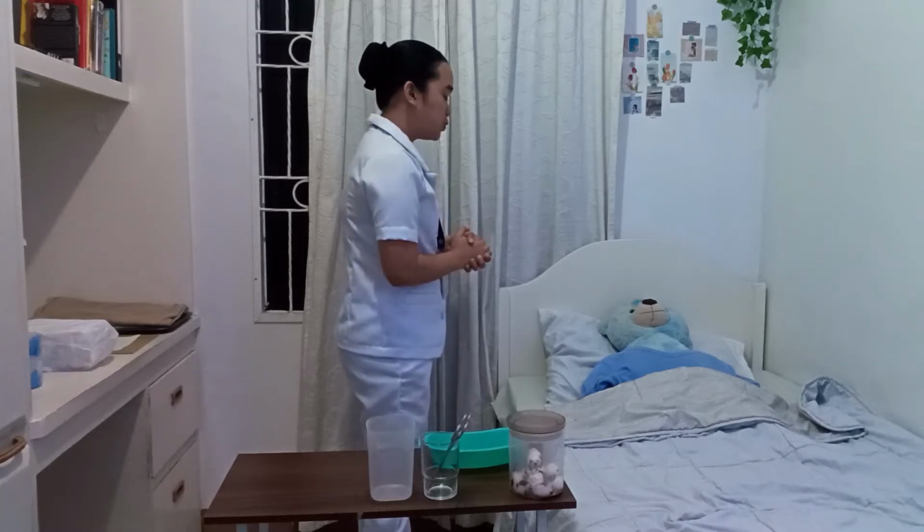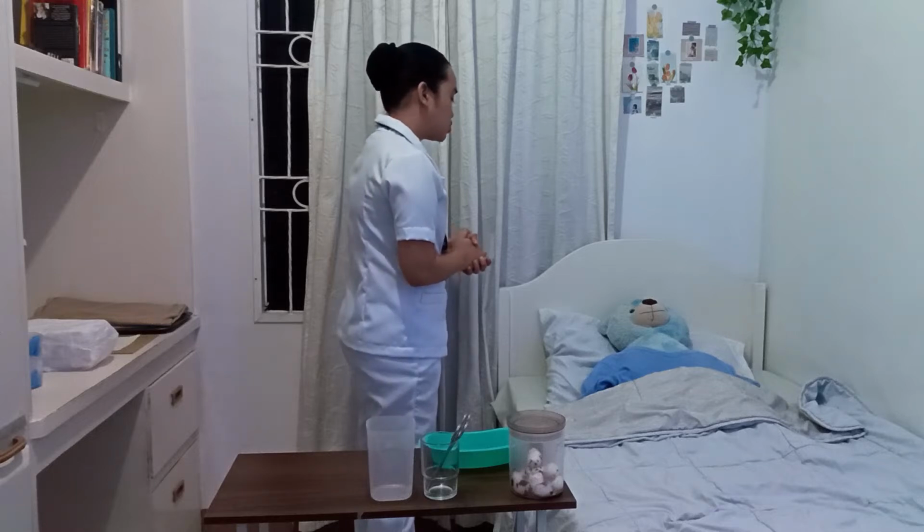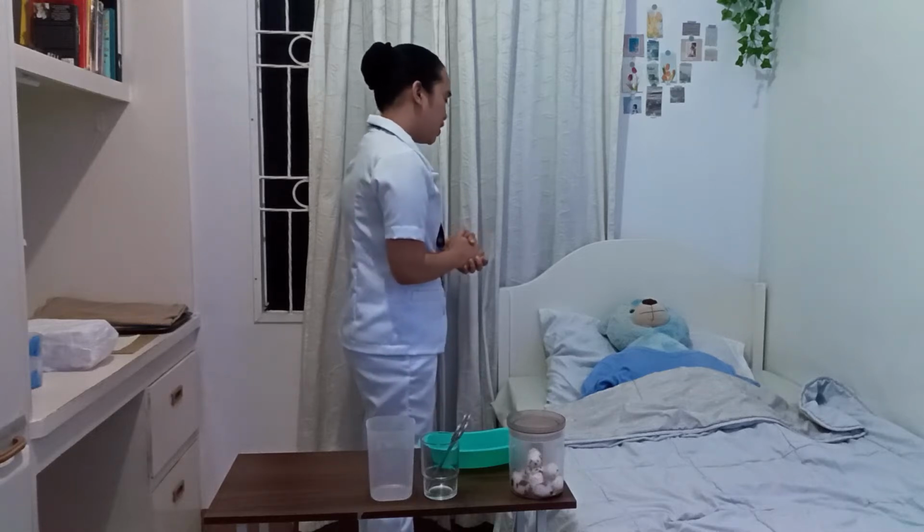Okay, so ma'am, is it okay if I'll close the curtains and doors for me to provide you with some privacy and away from disturbances? Alright, thank you.